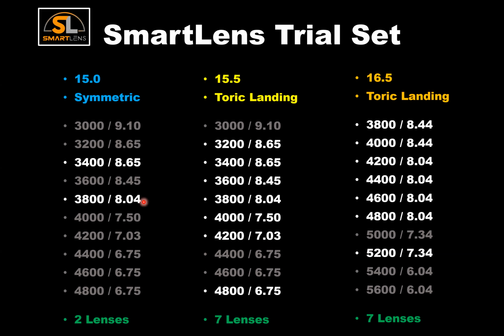In cases where the eye is very small in diameter, we can use a smaller diameter scleral lens. In cases where the eye is incredibly deep set and it's difficult to apply that lens to the patient, then you have a small lens option that gives you the ability to place the lens on eye in a less problematic manner.